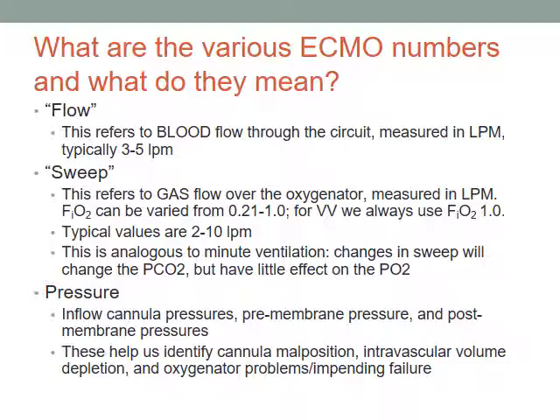That has been replaced by centrifugal for a lot of reasons. A big part of it is safety. If you had an outflow obstruction and a roller that was still turning, it would explode the tubing. You could burst it. It's called a raceway disaster. Your patient died. So we don't have that technology here. We never have had it.